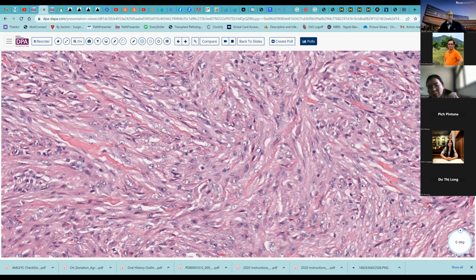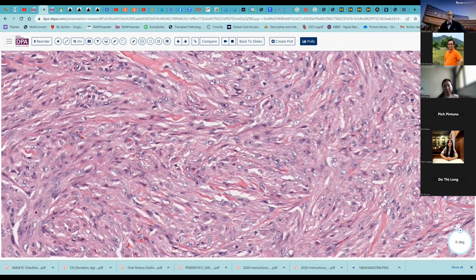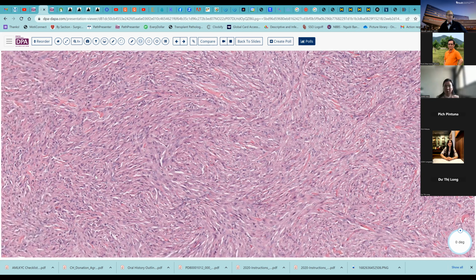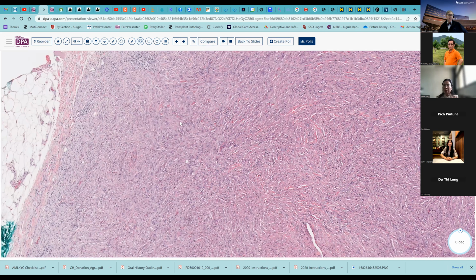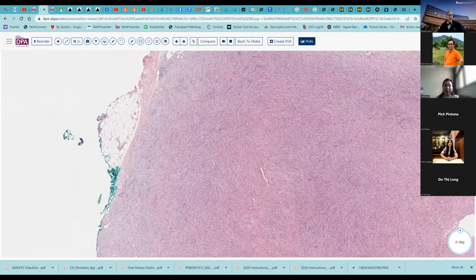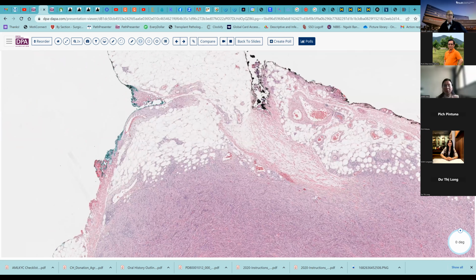And so it's expected that a lesion that's been present longer may be more uniform like this, whereas, as we'll see in a minute, some of the more, how would we say, recent onset lesions might have less of a dense cellularity like this. Now, usually it will be fairly rounded and circumscribed, but fortunately, resection margins are not critical in this lesion because the recurrence risk after surgical excision is very, very, very low.